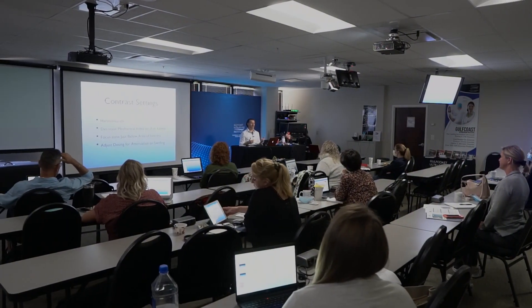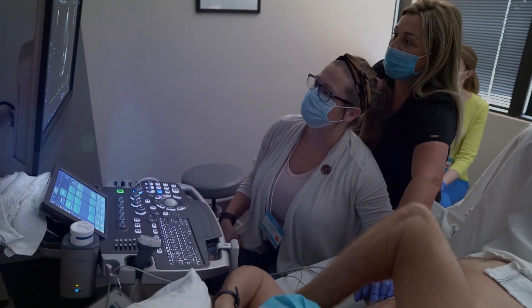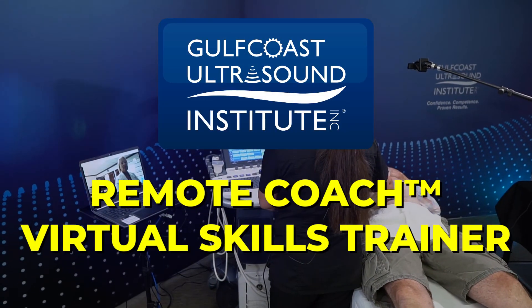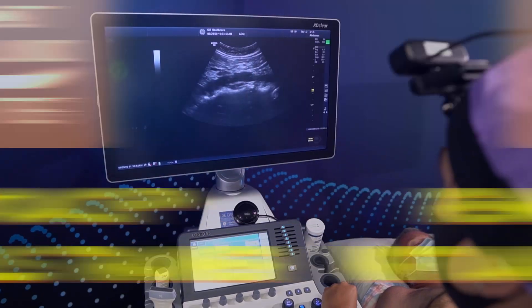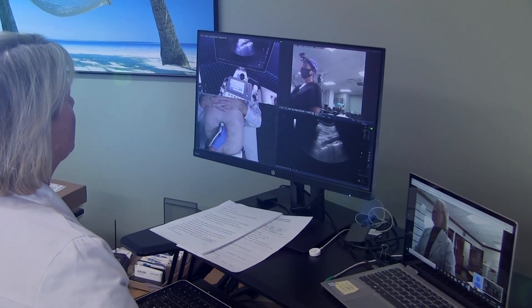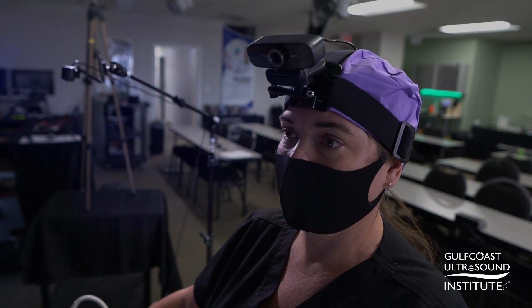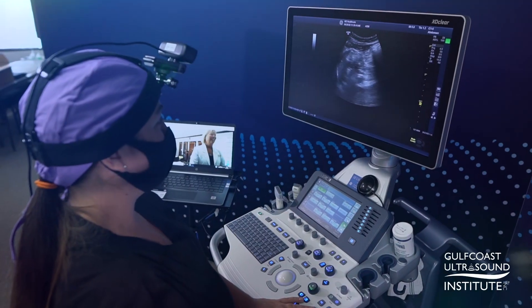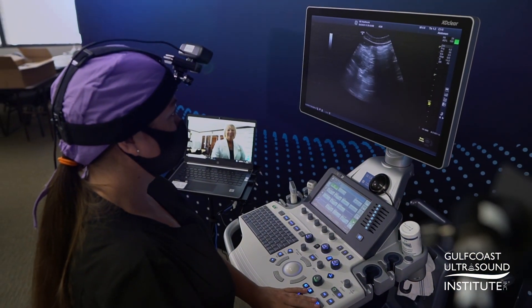Need to learn ultrasound but can't travel to a live course for hands-on education? We've got your solution. The Remote Coach Virtual Skills Trainer from Gulf Coast Ultrasound uses the latest technology and innovative teaching methods to provide individuals and groups with comprehensive, interactive skills training in your chosen environment.